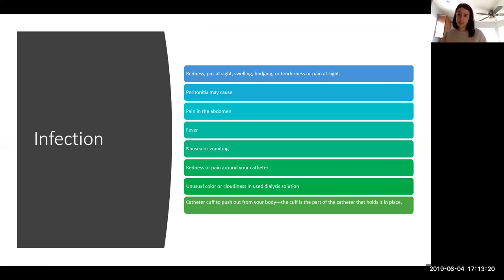So infection is huge. You do have a catheter that is still hooked up to your abdomen. So we did it under sterile technique when I was touching the actual catheter going into the peritoneum.